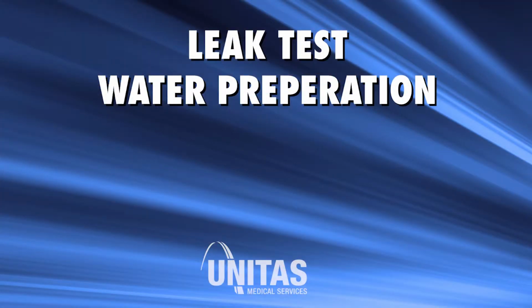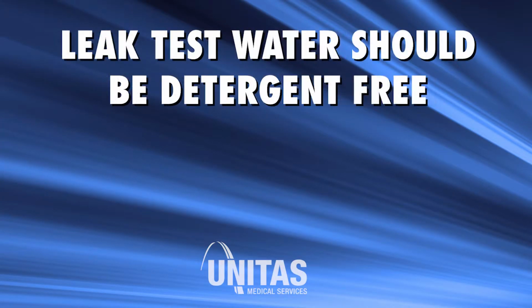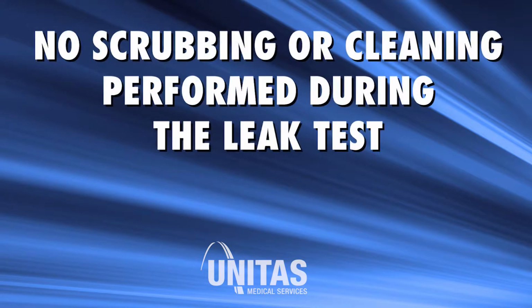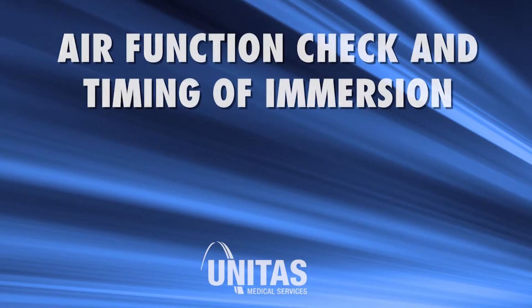Leak test water preparation. Leak test water should be detergent-free and the test time dedicated to visual examination, so there should be no scrubbing or cleaning initiated during leak test.